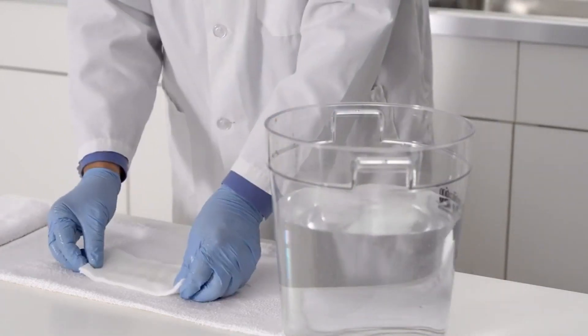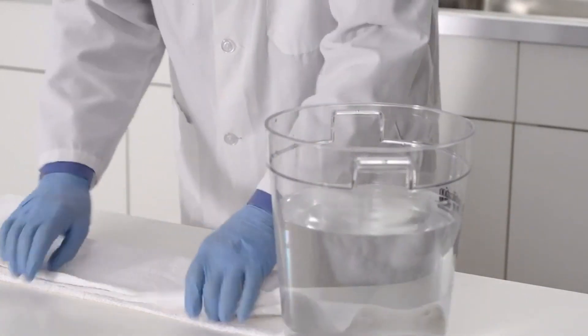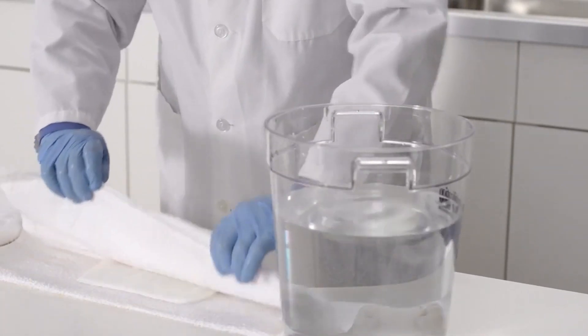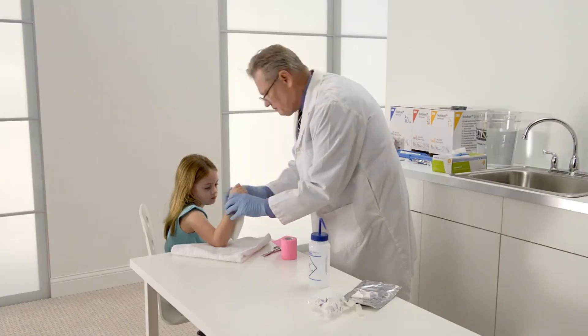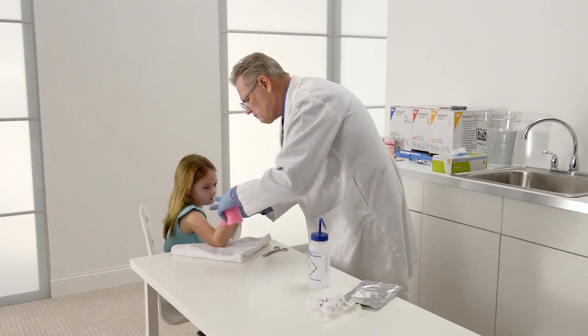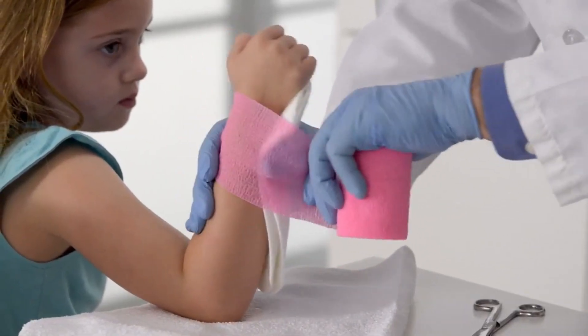Using water that's room temperature provides approximately three minutes of molding time. To extend the working time, use cooler water. Once your splint is wet and excess water has been removed, apply the splint starting at the distal palmar crease, allowing it to follow the natural contours of the forearm.